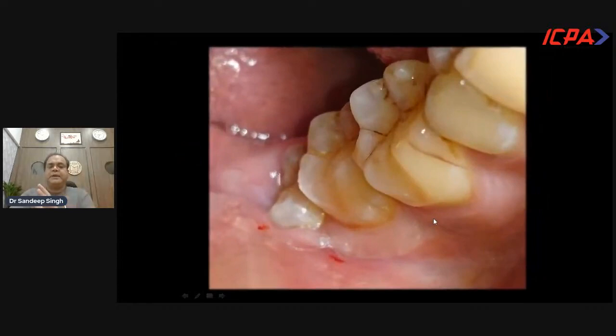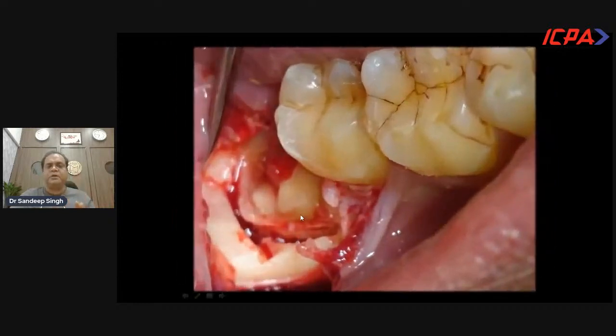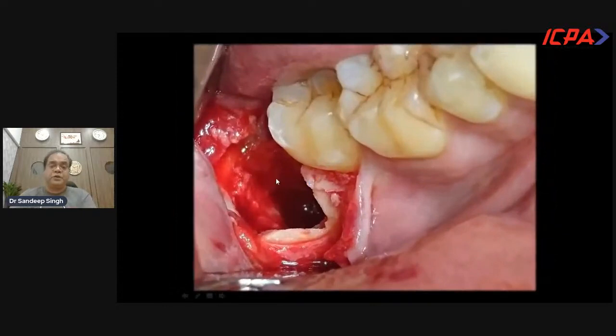And other than that, when you do a last molar extraction while doing implant, you can use that impacted tooth as a dentin graft to that area. But if you're just doing impaction, I always tell my patient that, look, healing with a dead space will take a lot of time. But the tooth which I have taken out, I'd throw it into the dustbin. If I use it as a dentin graft and pack it again into the socket, the healing will be faster.